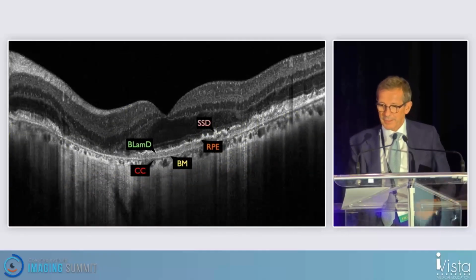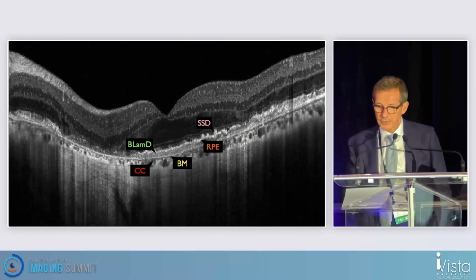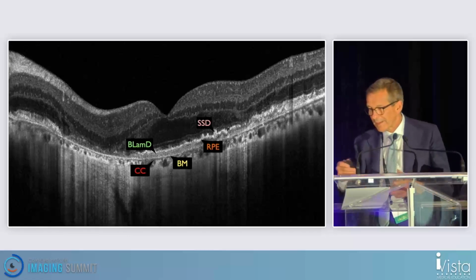The other interesting thing is the visualization of basal laminar deposits or basal linear deposits.